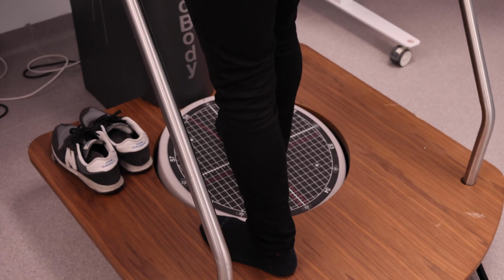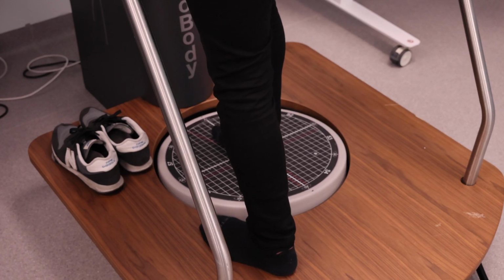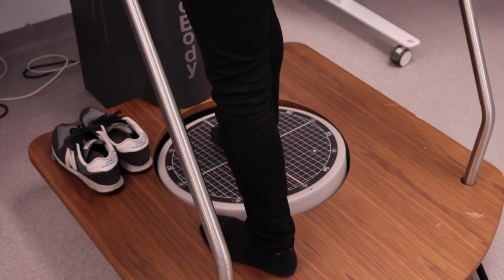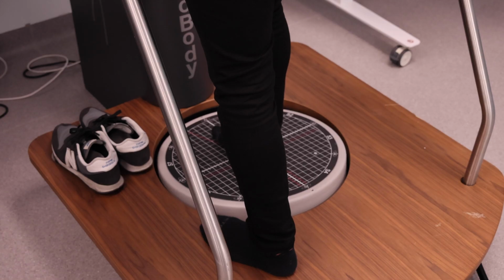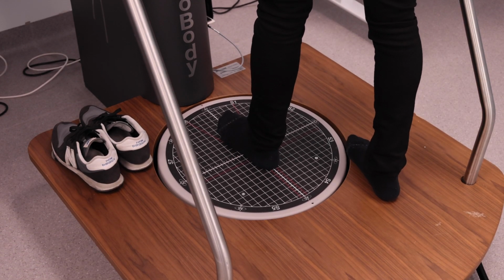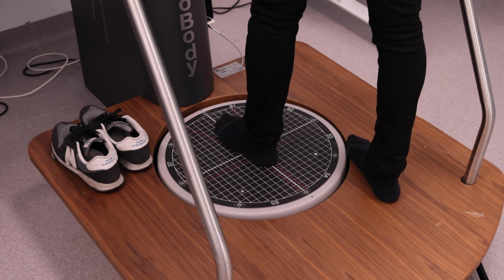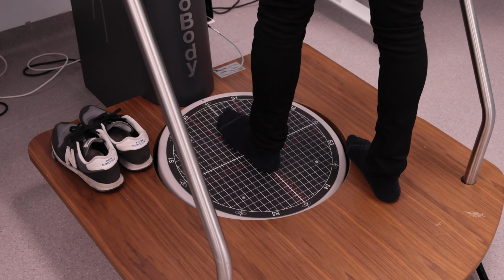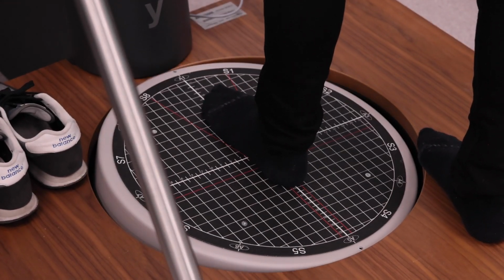This has to be done with the involvement of all the lower limb, starting from the hip, knee and ankle. There are 3 rounds to perform with the right leg and with the left leg. As soon as completing the first round with the right or the left leg, the software will ask to change the leg, the other lower limb, and to perform the same test. At the end, we can compare the error to the trace, right and left, and check for the progression of the patient in terms of lower limb control.